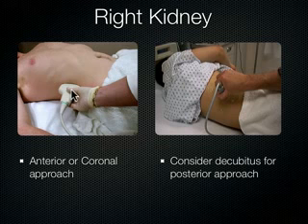Occasionally, though, you got to take the probe and drag it up anteriorly, up here. But whenever you drag the probe anteriorly, keep in mind the kidneys are still kind of a posterior structure, so to compensate for dragging the probe anteriorly, you're going to want to also fan the probe posteriorly.